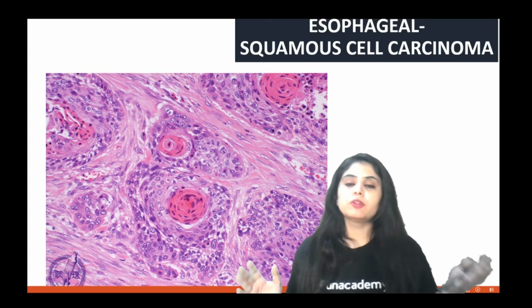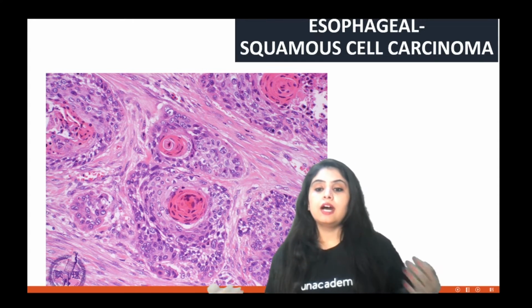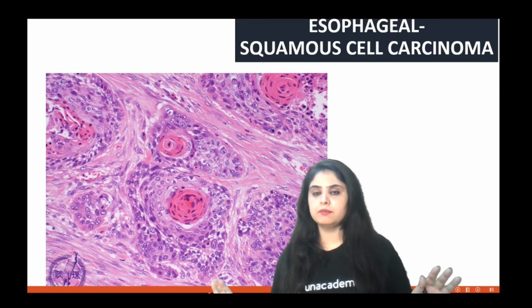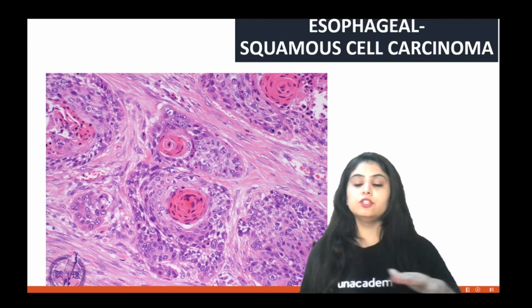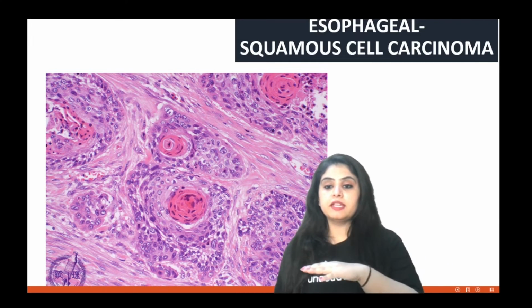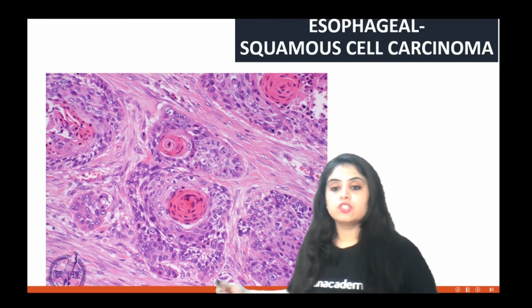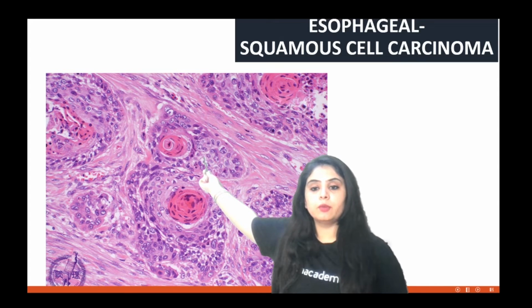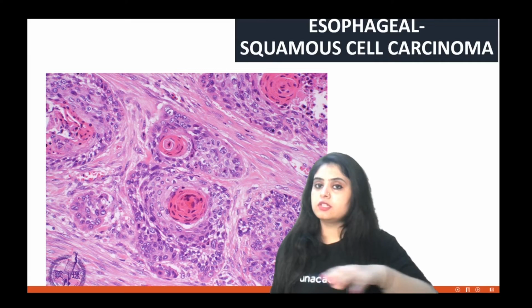So anywhere you talk about squamous cell carcinoma, this similar picture is going to come up to you. How do you identify it? First point, you notice that this is a usual pink and blue slide, so this is the H&E section. The first thing, you don't see the cells arranged in a sheet, right? They are arranged in these islands. Number one, then number two, then another one here, another one at the top. So they are arranged in these islands, not in a sheet.